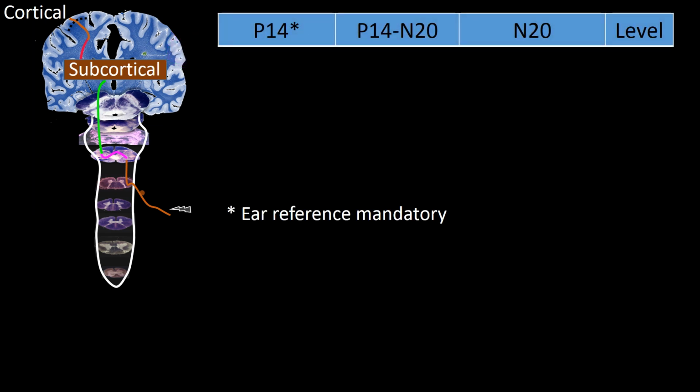Whereas cortical potentials have only been used for prognostication, subcortical potentials can also be used to suggest localization, possible pathogenesis, which can lead to suspect a specific etiology, and prognosis. For these purposes, 3 parameters have been used to describe a level of involvement. The parameters used are P14 normalcy or absence. For recording P14, a cephalic electrode, usually in the centroparietal region ipsilateral to the stimulus, must be connected to an ear reference or another extracephalic reference, as is the contralateral ear point.